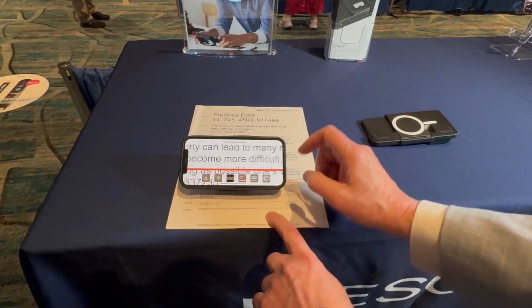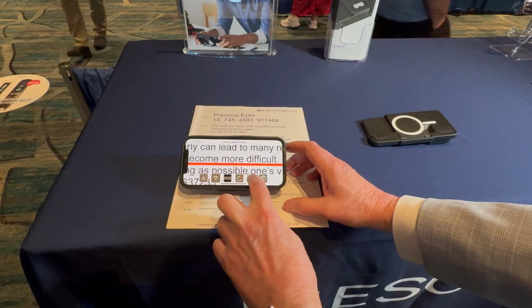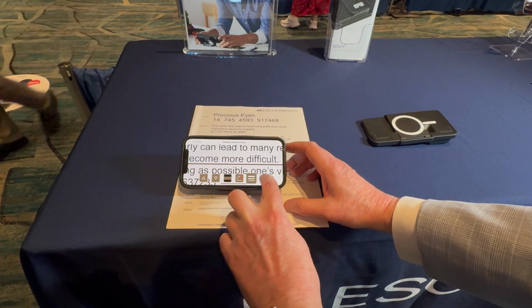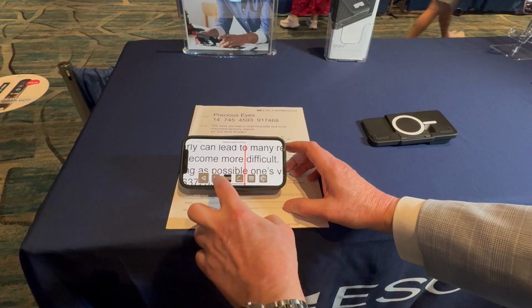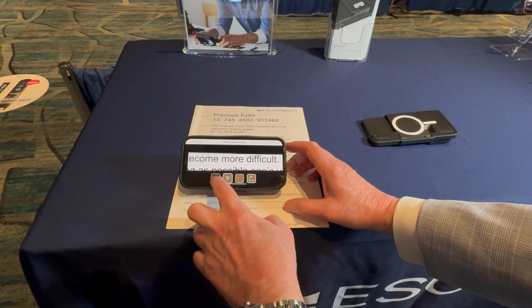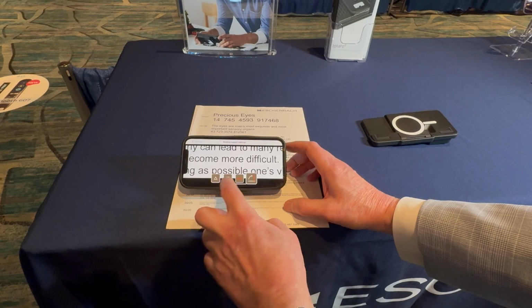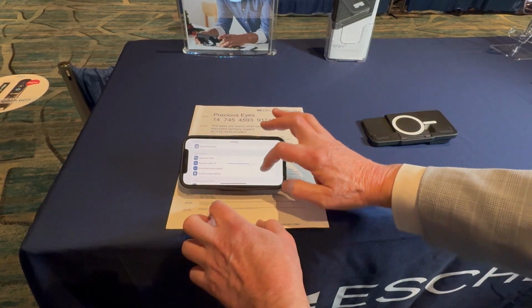You can change the reading line support settings. This is where you can make the line go up or down. You can change the thickness of the line. You can change the color of the line. You can change the orientation of the line, and you can move that across left and right as well. In addition to the underline feature, there's the blinds feature, so you can make that more narrow, wider, and also change the orientation. So all these different things you can actually change here in the settings mode.